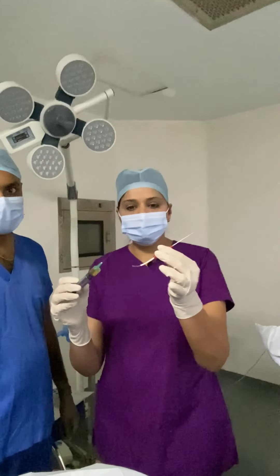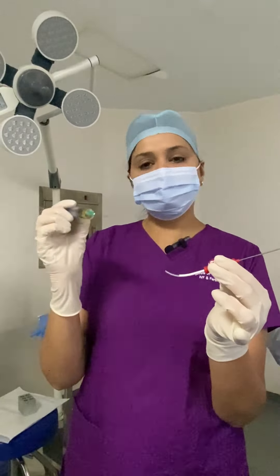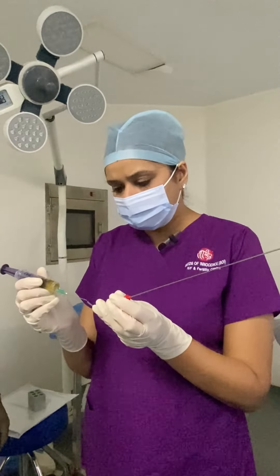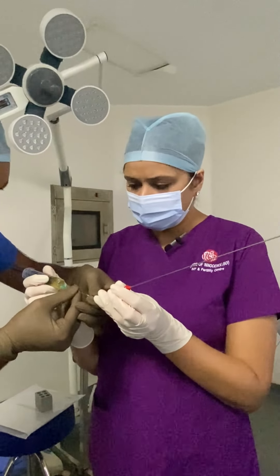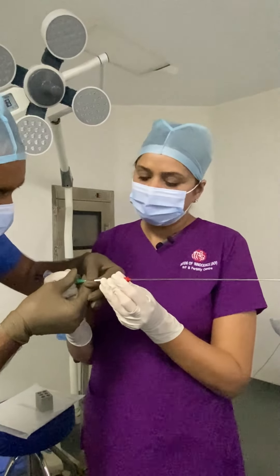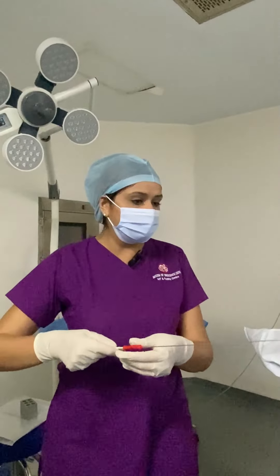Now what we will do is load the PRP into a syringe and attach it to the ovum pick-up needle. We put this syringe into the ovum pick-up needle.